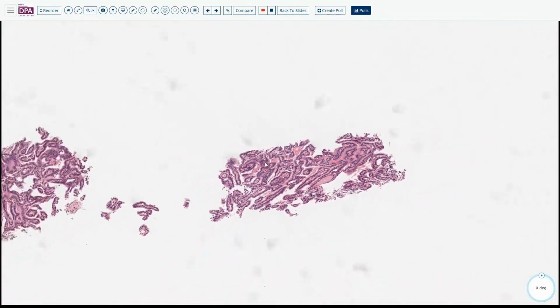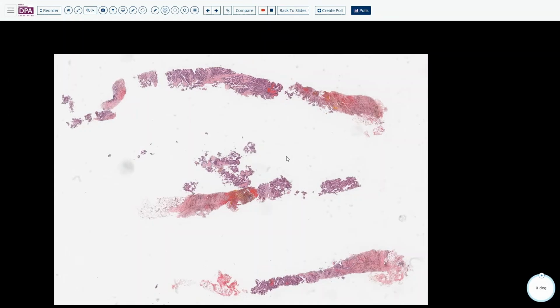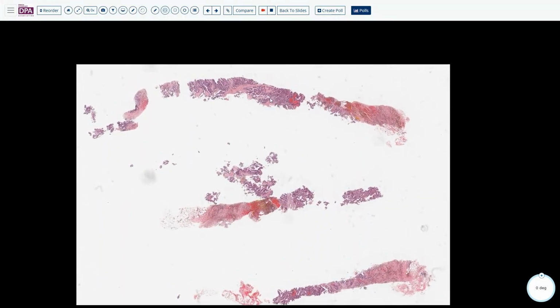So, another good thing is that when you see this kind of lesion, you do not see any DCIS. Whenever you don't see any DCIS, just this carcinoma, you need to think about, is this truly breast? Of course, we can do other staining like TRPS1 and GATA3 to prove this is the breast.